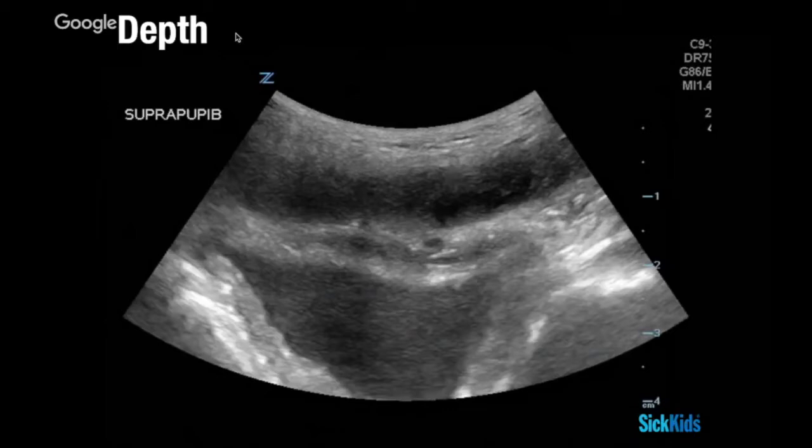And when I set my depth on the screen, that's all I'm really doing for the machine. Yes, it's going to look a little bit magnified, but it's not just that the machine cuts out the bottom and still processes it. It doesn't even bother processing the bottom. So setting your depth right really does help produce better images by allowing the machine's processing power to focus where you want it to focus.